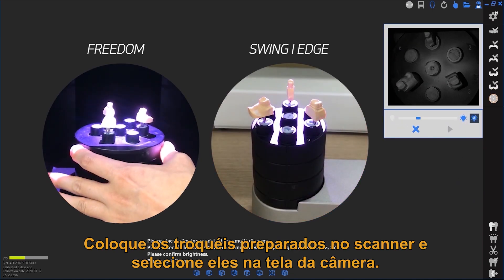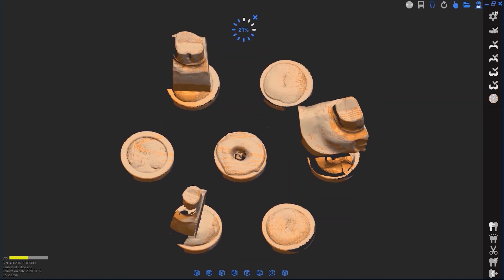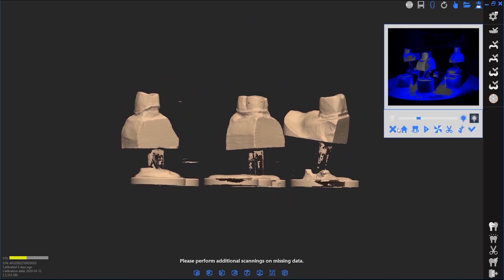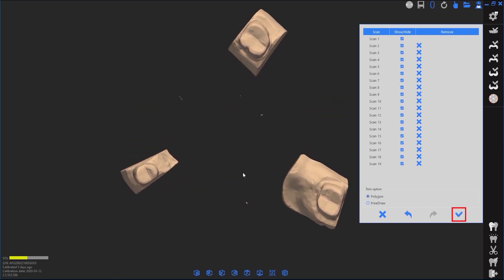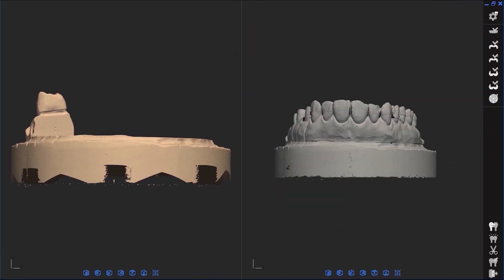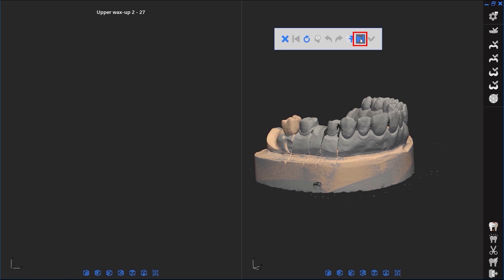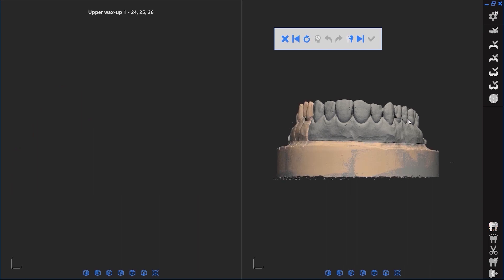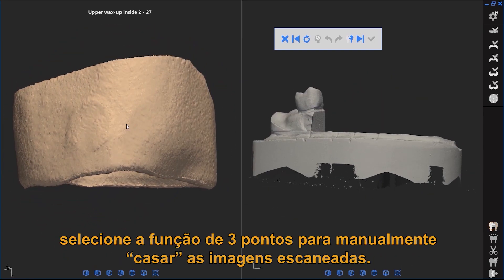Place the prepped dies in the scanner. If it fails to align automatically, use the function to manually match scan data.